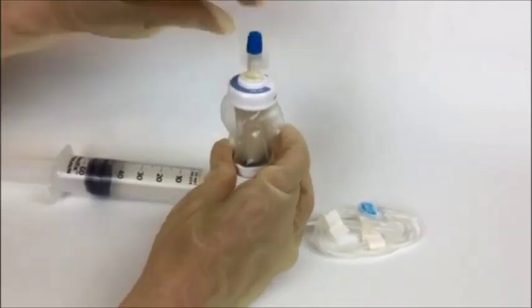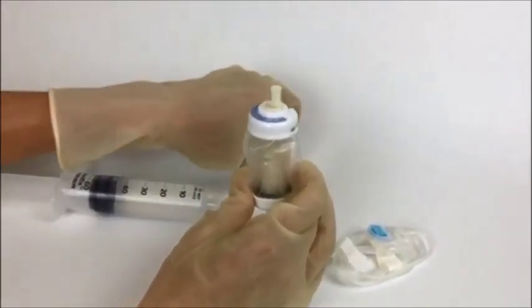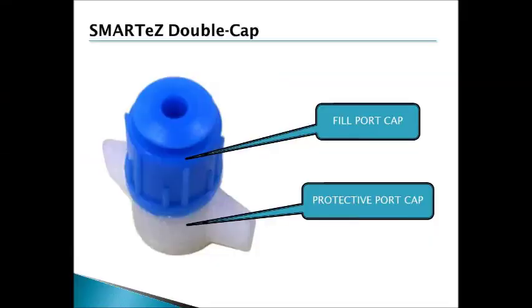To use the new double cap pump, begin by unscrewing the disposable protective port cap from the pump while keeping the sterile color-coded fill port cap attached to allow the disposable port cap to protect the sterility of the color-coded fill port cap until after filling.